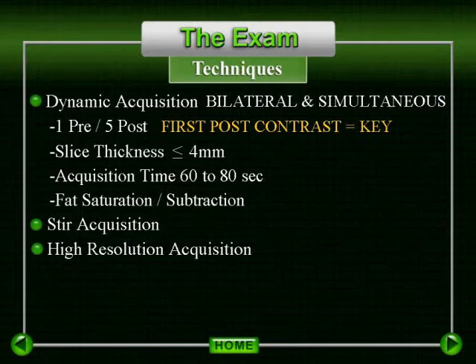Initially, in our practice, we performed high-resolution fast-spin echo T2 weighted images. We tried to always perform the high-resolution acquisitions in orthogonal planes. We find this especially useful in evaluating lymph node morphology, whether in the axilla or, more importantly, identifying intramammary lymph nodes, which can demonstrate concerning enhancement kinetics and potentially be mistaken for malignancy if their characteristic morphology is not recognized.